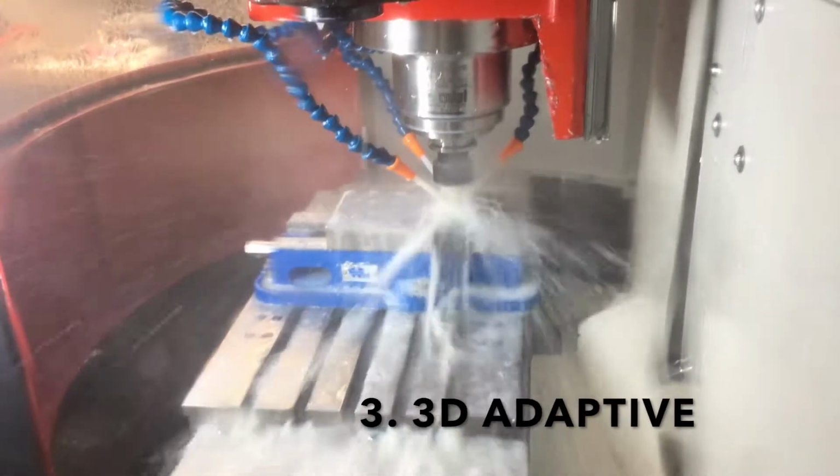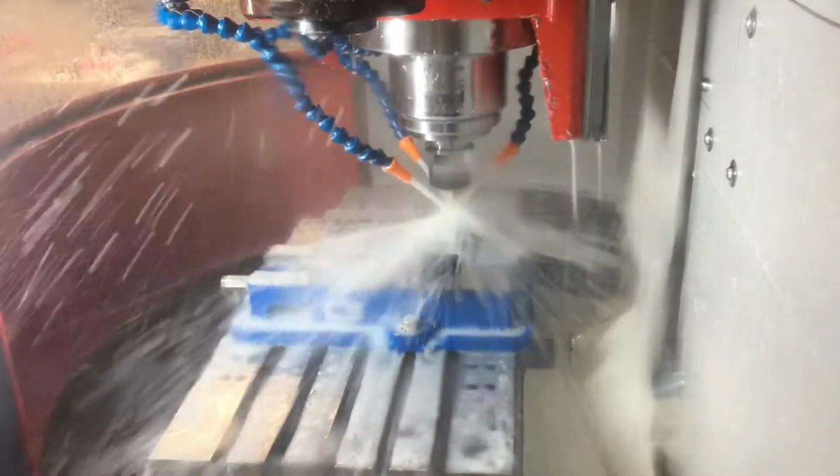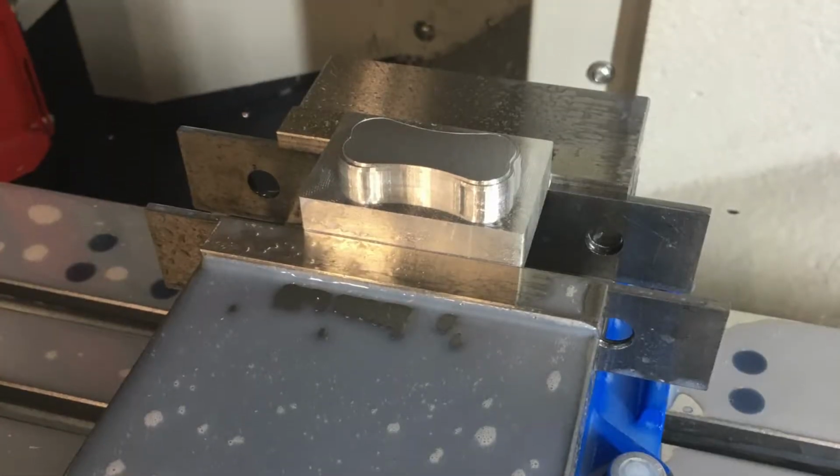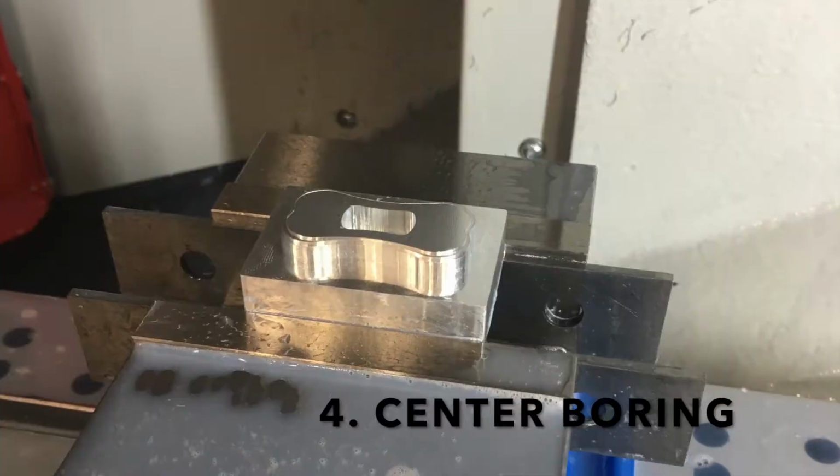Number 3. A flat bottom end mill is used along with a feature called 3D Adaptive, which contours a rough blueprint for the 3D profile of the part. Number 4. An end mill is used to cut out the shape in the center.